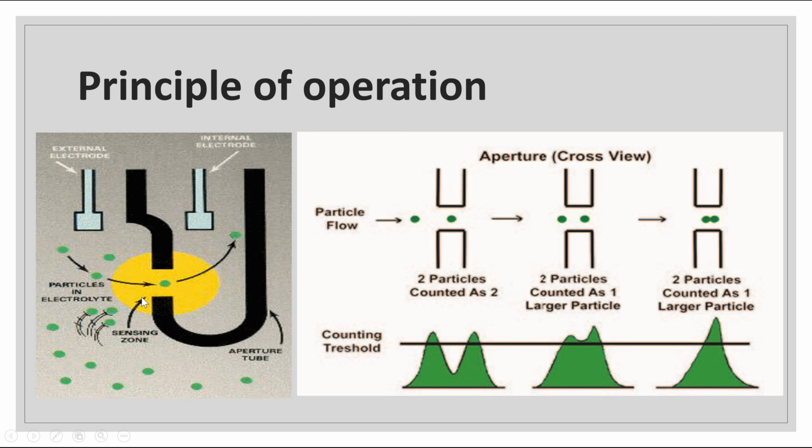Here they need to add a conducting liquid in order for the electrodes to tell the difference between the changes. These changes will be based on the size of the particles themselves and the speed they flow through it, because they go under the same setting, but they differ in the amplitude given and the period for each body.